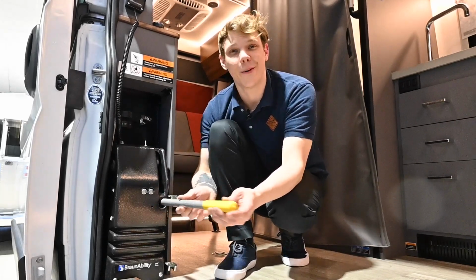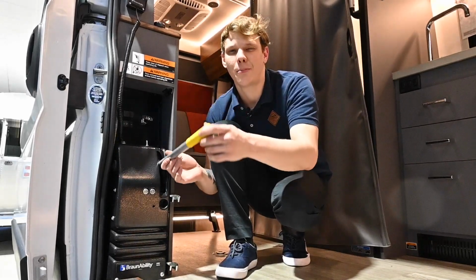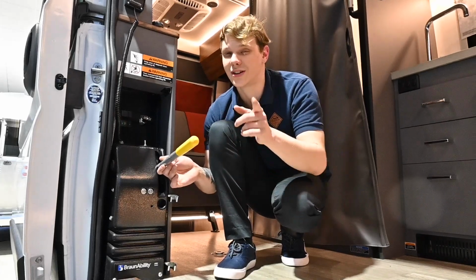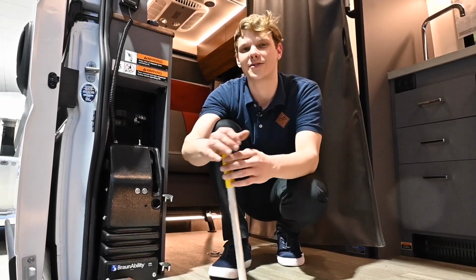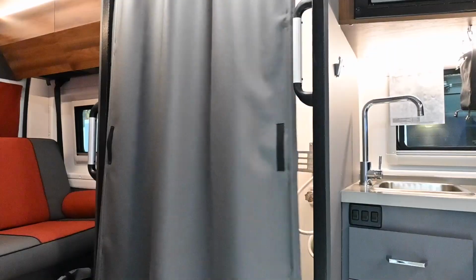In order to move the lift up and down, you're going to have to take your lever, align it again, and actually pump it right here like a car jack. Now keep in mind that this should only be used in the case of an emergency. If there's an issue and you need to get the lift serviced, there are hundreds of mobility work service centers around the US. Within just 100 miles of Colonial, there are 24 alone.